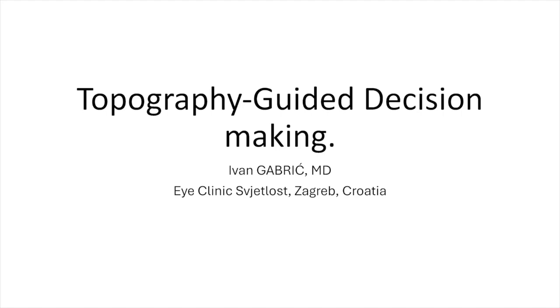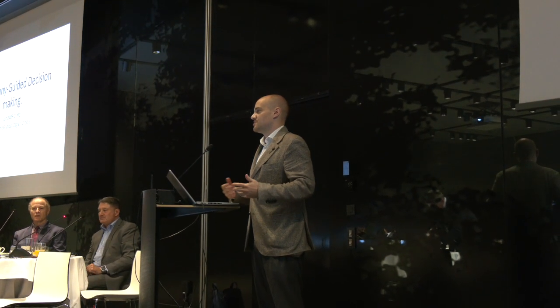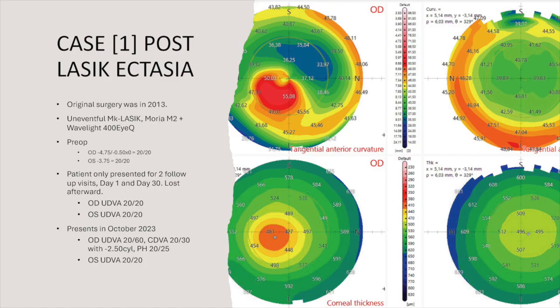So, when Francesca asked me to talk about something, I wanted to talk about my biggest passion, and that's evaluating lenticular surgery. But then, not everyone is a lenticular surgeon or is interested in that. So, I decided to make something else and talk about how we use CSO to make decisions in some difficult cases. So this is a type of case that we all fear.